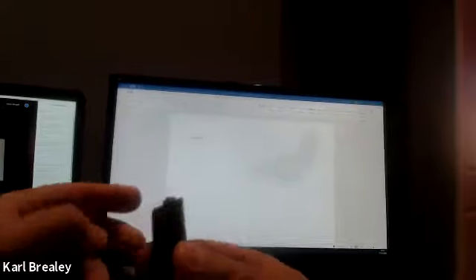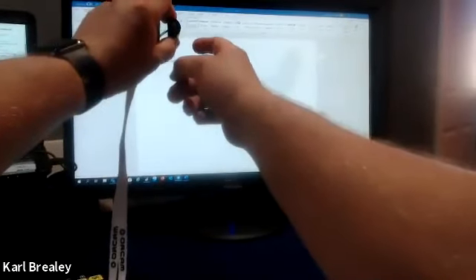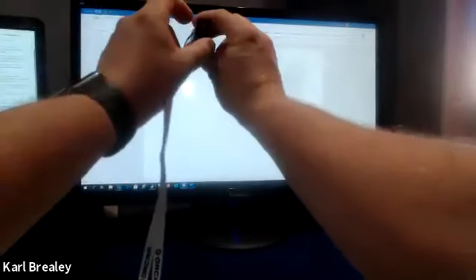All I've managed to put on there is literally 40 plus 40. Apart from it's now reading all the, hang on. Oh, there you go. I don't know if you actually heard that. It did actually read out the sum.